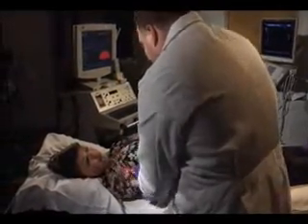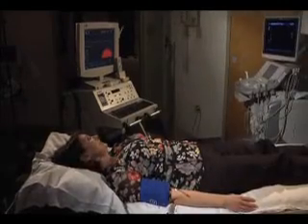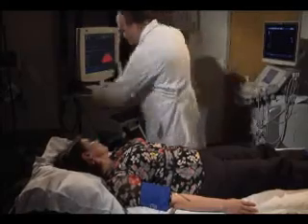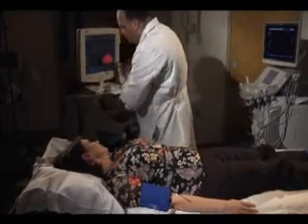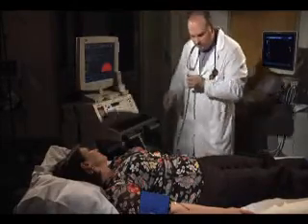So this is just like having your blood pressure taken, just in four spots. We do it a little differently — instead of using the stethoscope to measure the blood pressure, we're going to use a Doppler, which measures only the systolic, or the top number of the blood pressure. That's the number that's important.